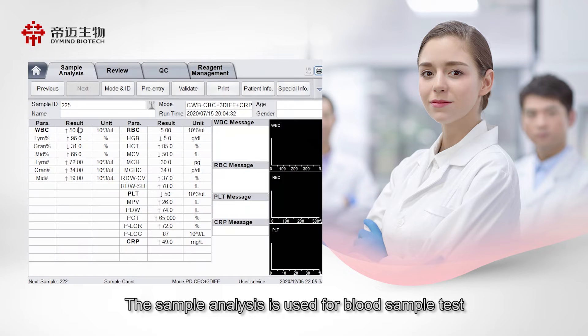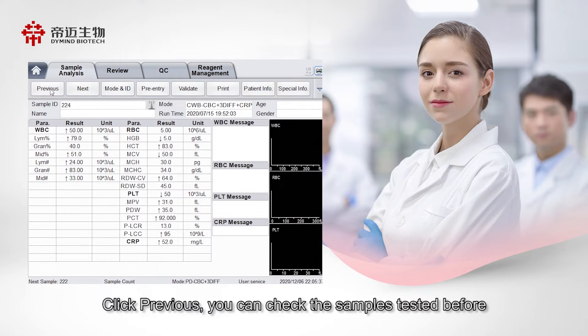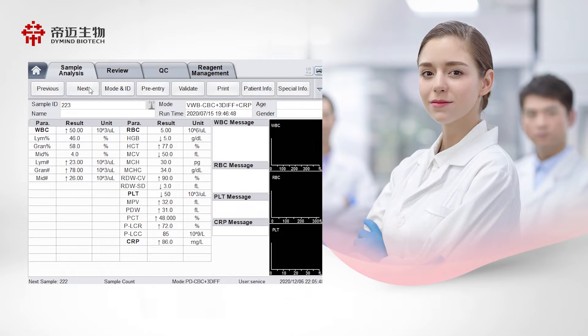The sample analysis interface is used for blood sample testing. Click Previous to check the samples that have been tested before.